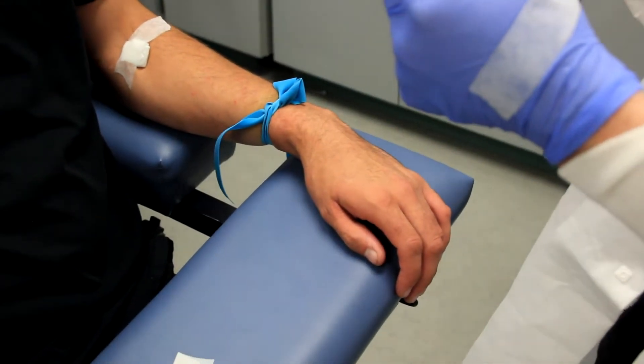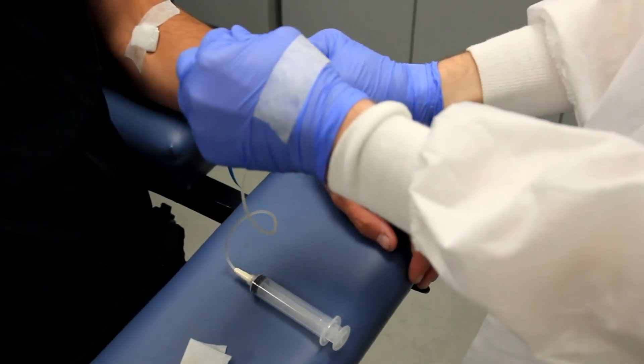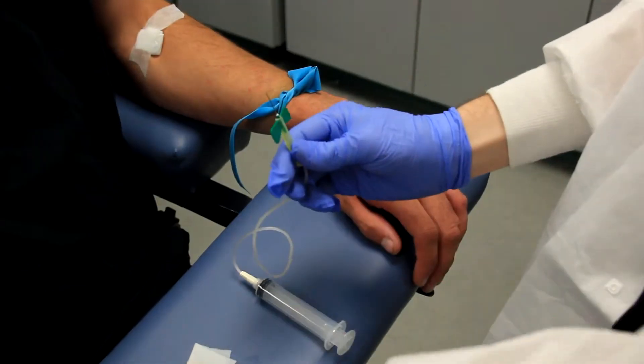A small plastic sleeve protects the needle until ready for use. When everything has been prepared, simply slide the sleeve off and proceed with your venipuncture as usual.